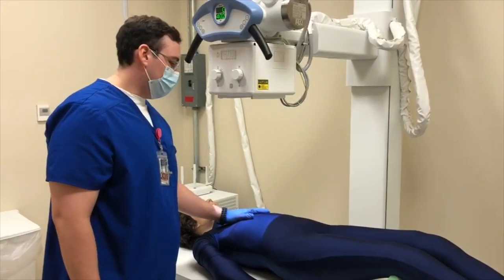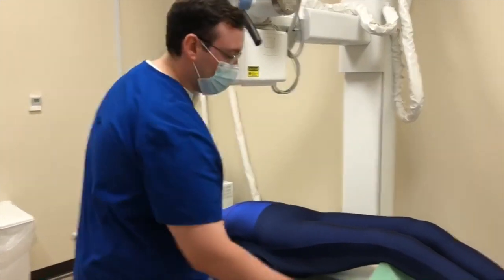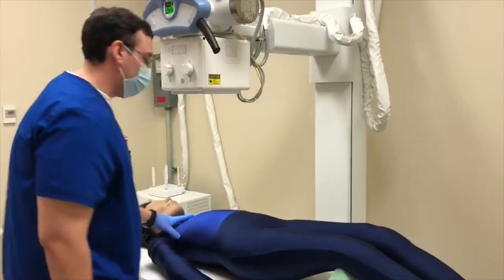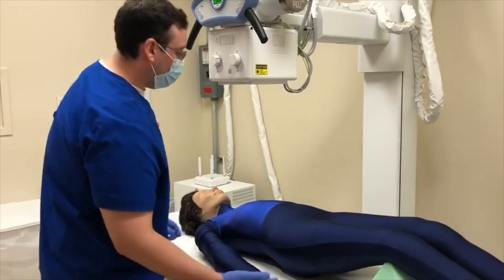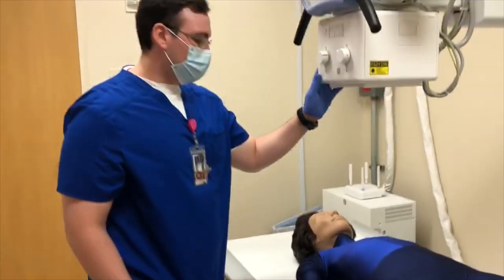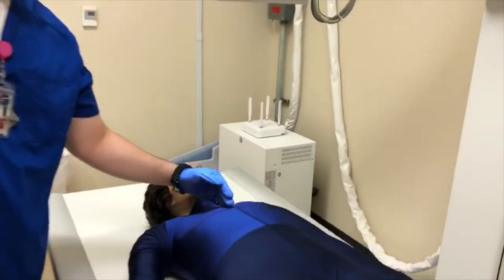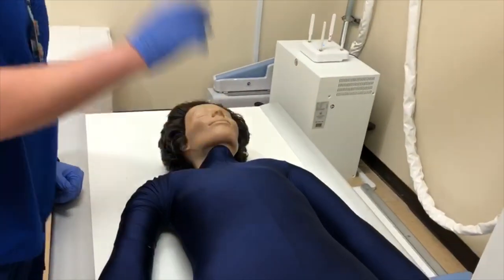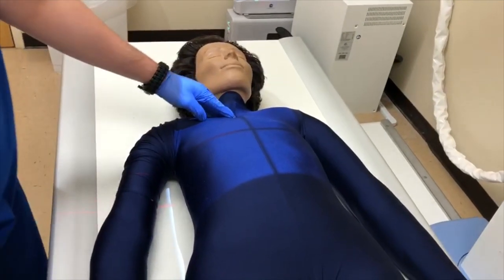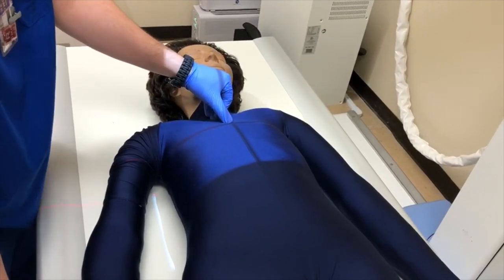You'd have them laying straight on their back, and you would put a cushion underneath their legs or knees to lessen the curvature of the spine. You'd have their arms straight to their sides. And to get the CR lined up, you go CR on the mid-sagittal plane, and you're going to position it 3 to 4 inches below the jugular notch. So you're going to go down 3 to 4 inches.